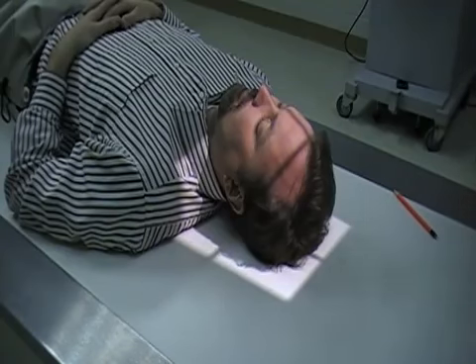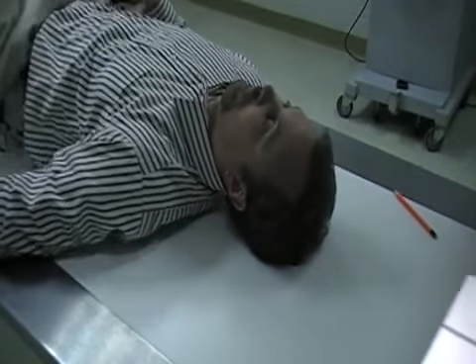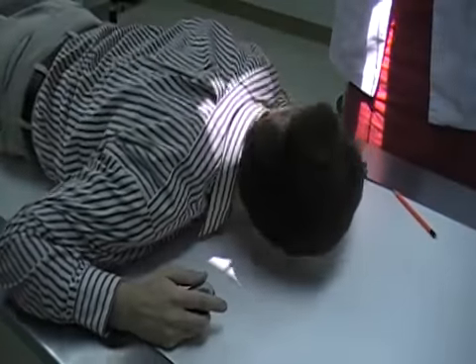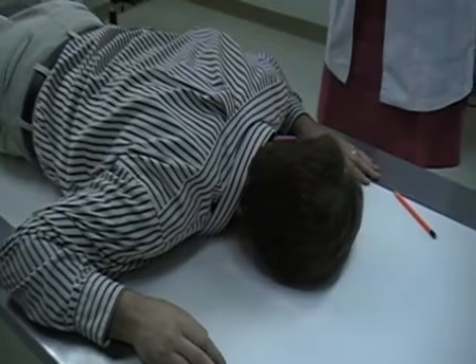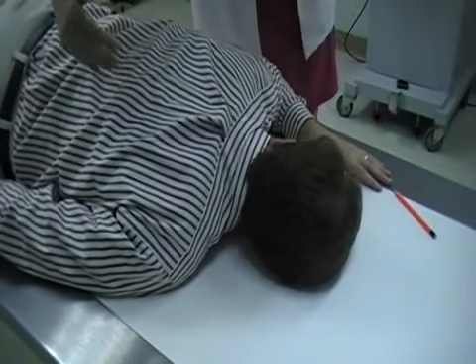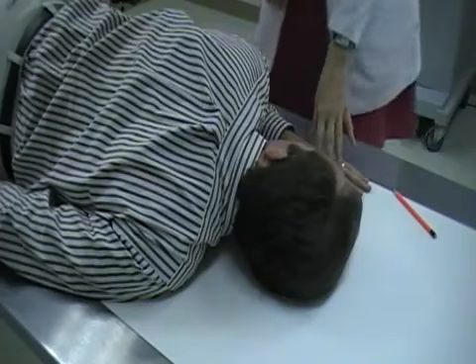Okay, next we're going to go do our laterals. Do right and left lateral. Have your patient prone, and we're going to do the right lateral first. So I'm going to put the right arm down by patient's side. Put this right arm down. I'm going to roll onto the right side and I'm going to have this left hand up in front of the face.